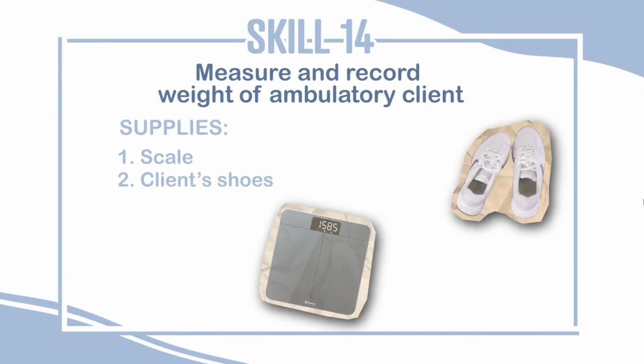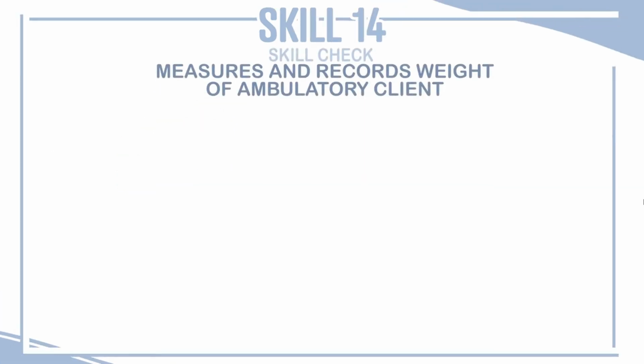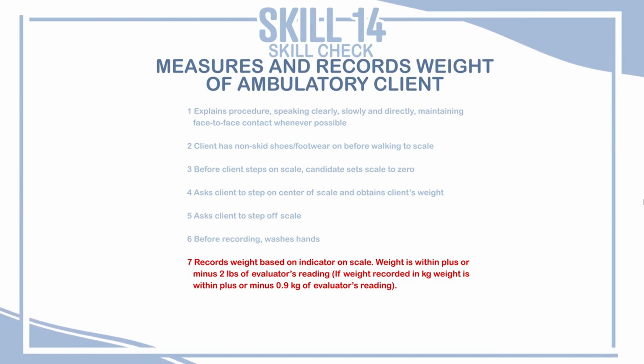The supplies you'll need to complete this skill include a scale and the client's shoes. Make sure to check these 7 benchmarks as you go to complete this skill.